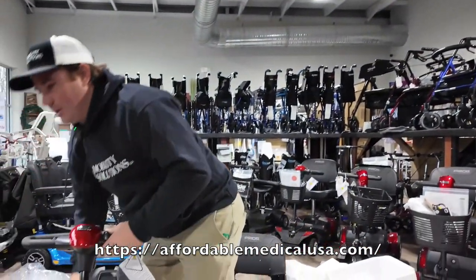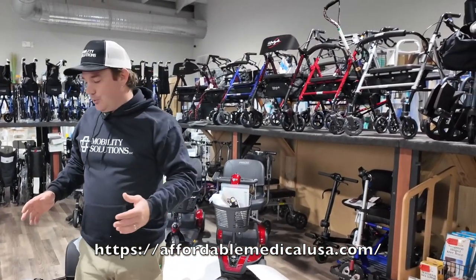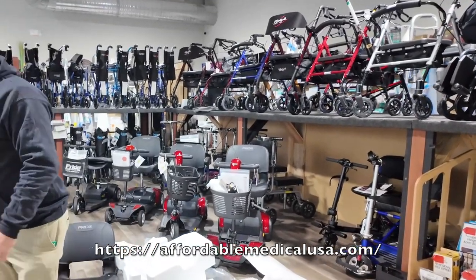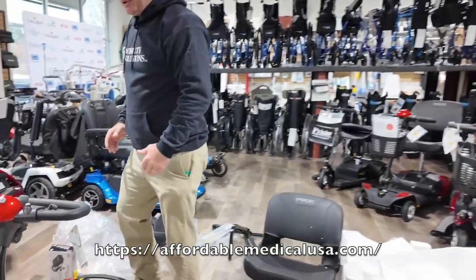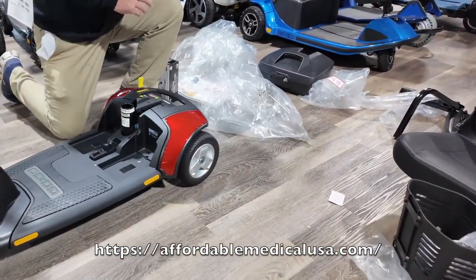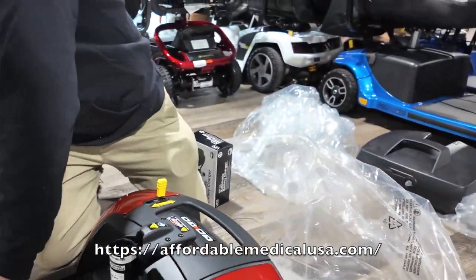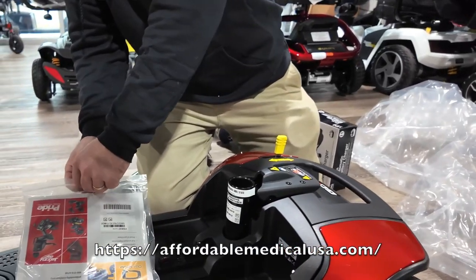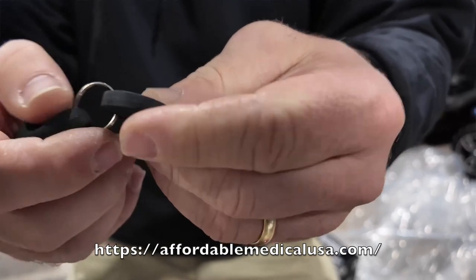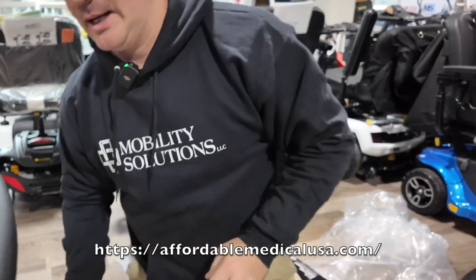This is a three-wheel and it's a small scooter. Even though it holds 300 pounds, if you're a bigger person, be careful because it can get a little tipsy. It's a very small but nice unit. Go back to your manual, get the key out — there's your spare key. If you want to take it off now, put it back in your manual for safekeeping.